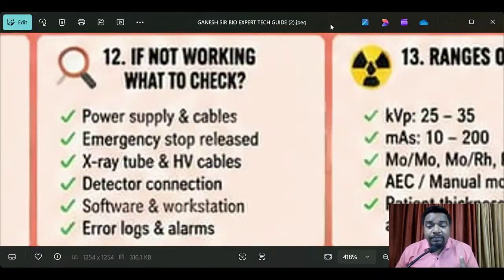Very, very important, because first of all we take the diagnostics, the X-ray, MRI and CT scan, whatever it is. Those are all radiology equipment. After that only, the patient's operation or surgery, the doctor will decide. Whatever diseases or problems we have in our body, we have to diagnose and find out the issues. We have that much technology. That is the reason I'm giving this today.